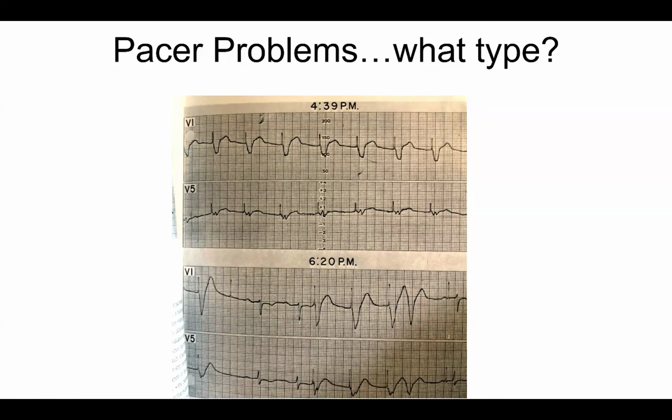The reason we don't do Holters is because the independent EKG stickers would fall off very often. So it's very common that you put a Holter on somebody in the office, and when you got the monitor back, there would be 11 hours of recording, and then it was just basically gone. So the general approach is it's better to have 3 days of consistent tracings of one lead than to have 11 hours of 2 leads. So might not be true, but that's how we think about it.